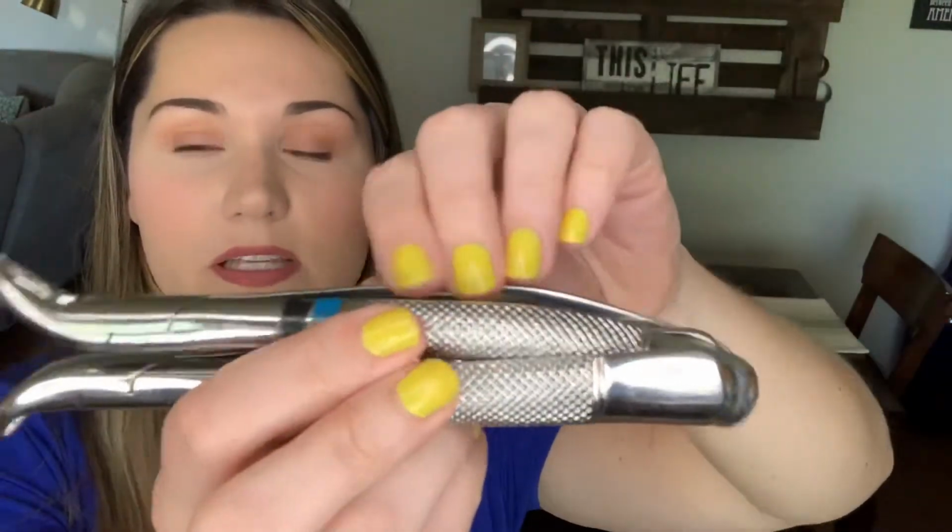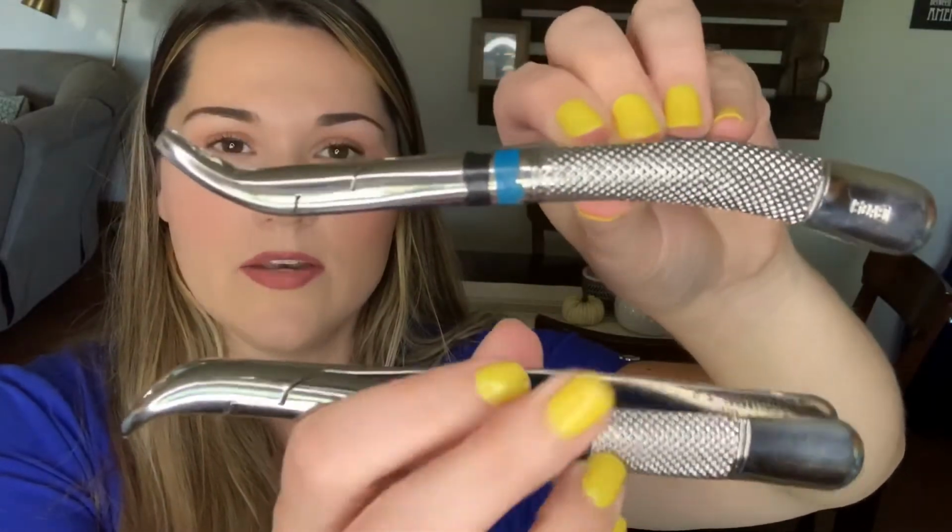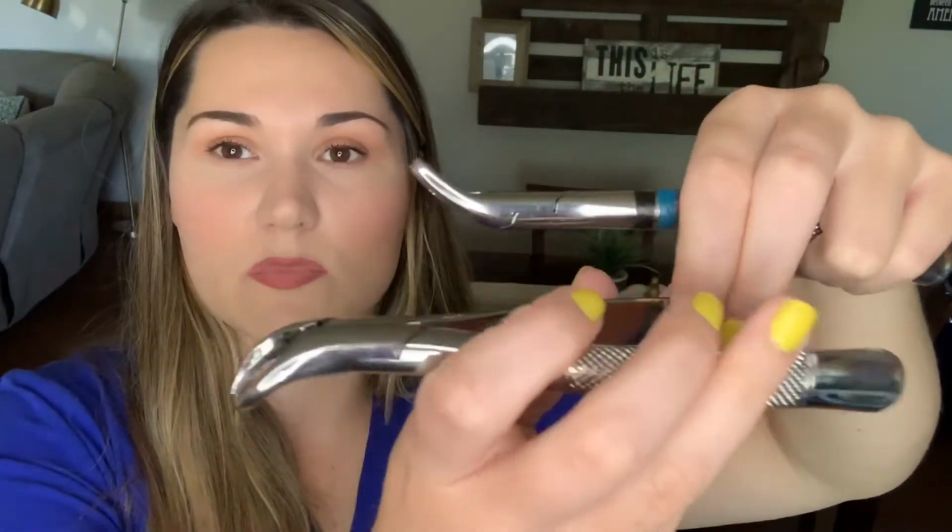I have a 150 here. So if you can see the difference of the shape, this is an upper, this is a lower, okay? And the dentist is gonna hold the upper like this because he's gonna be grabbing the tooth upward. And of course the lower one's gonna be lowered like so. But anyways, the 23 is meant, my dentist will use this if a tooth has a furcation or if it has recession, especially on a molar, because this is designed to get under the crown and it will kind of hook underneath the crown in between the roots just to get a really good grip on it.